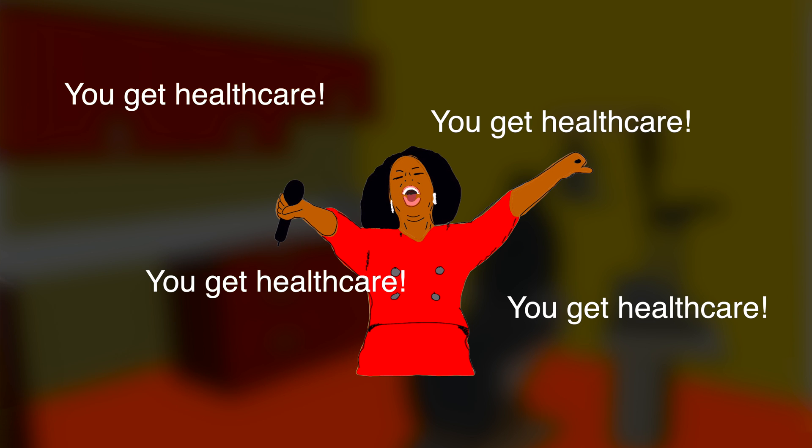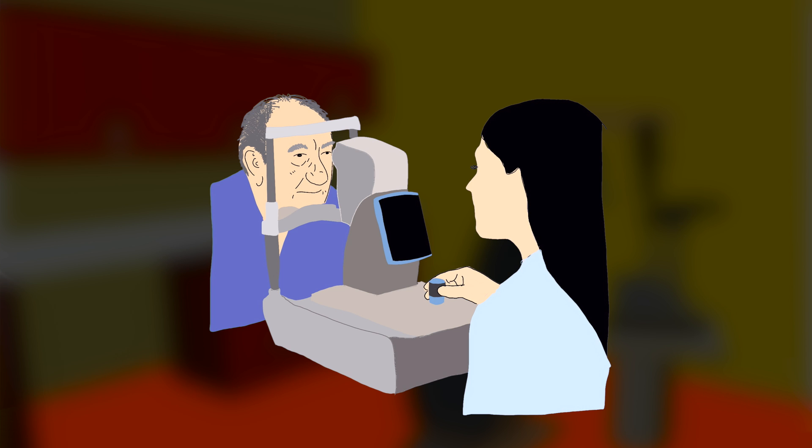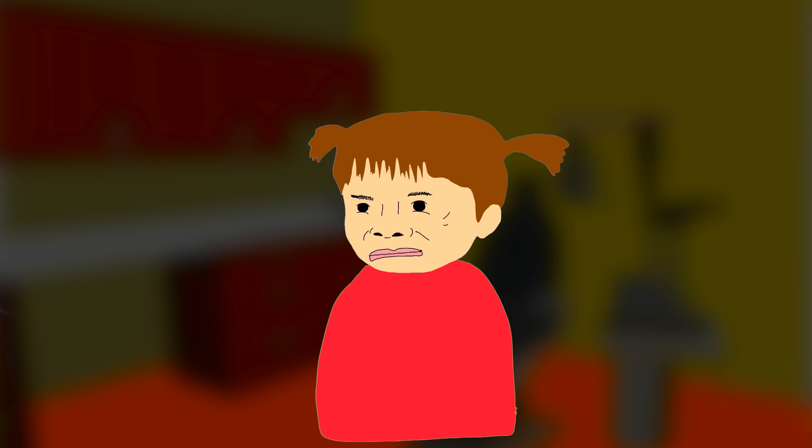So for the purpose of making healthcare more accessible to the population, some clinics will choose the air puff test. I have yet to find anyone who enjoys doing this test, but it is very much necessary. And it hurts to see people freak out every time I tell them I'll be shooting air into their eyes.